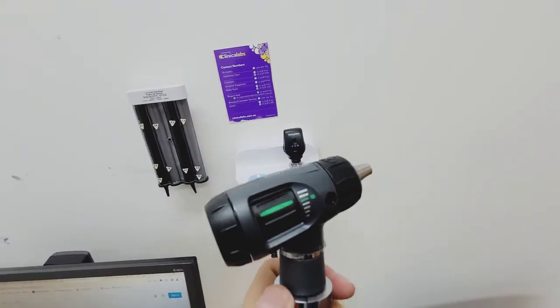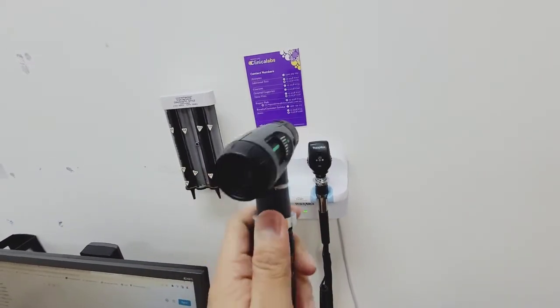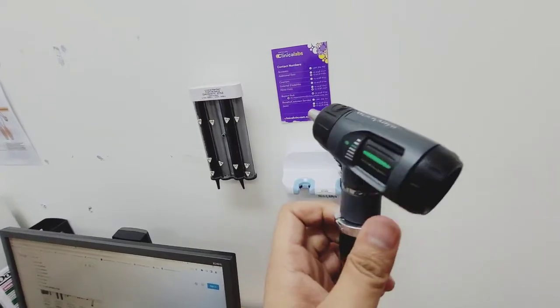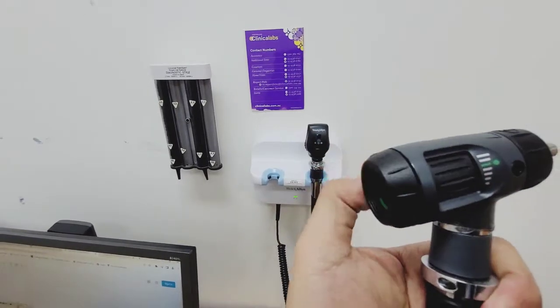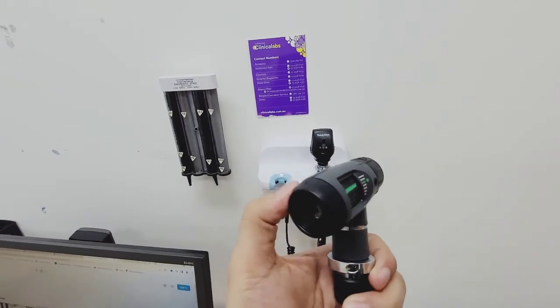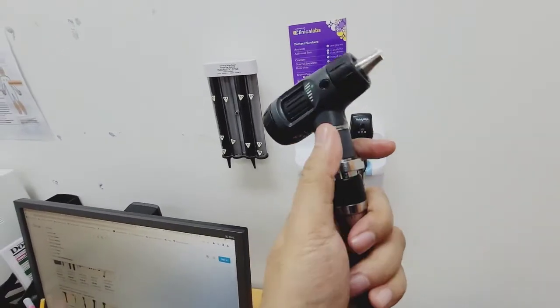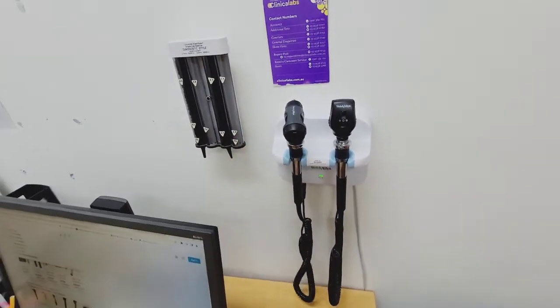Usually a lot of people complain of ear pain or a blocked ear, and most of the time it's due to infection, inflammation, water getting into the ears after swimming, or a buildup of wax. So we can see them using the otoscope, and then based on the diagnosis, we will formulate a treatment such as antibiotics, ear drops, anti-inflammatories, or painkillers. Because if you have infection or inflammation in your ear, it can be painful as well.